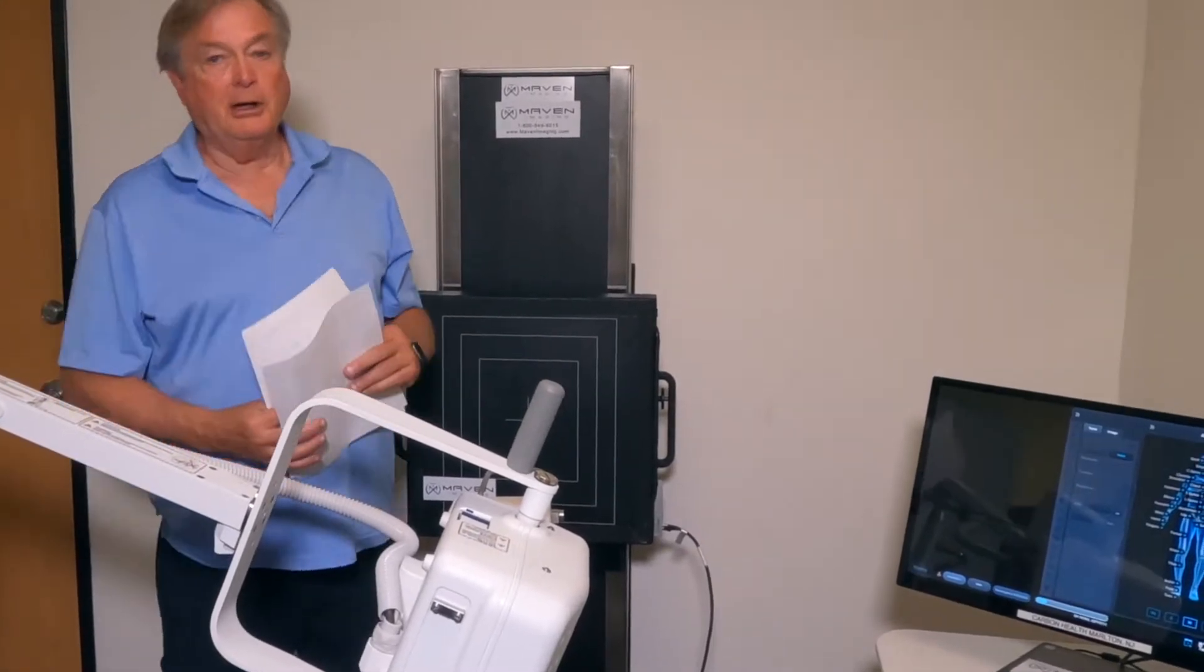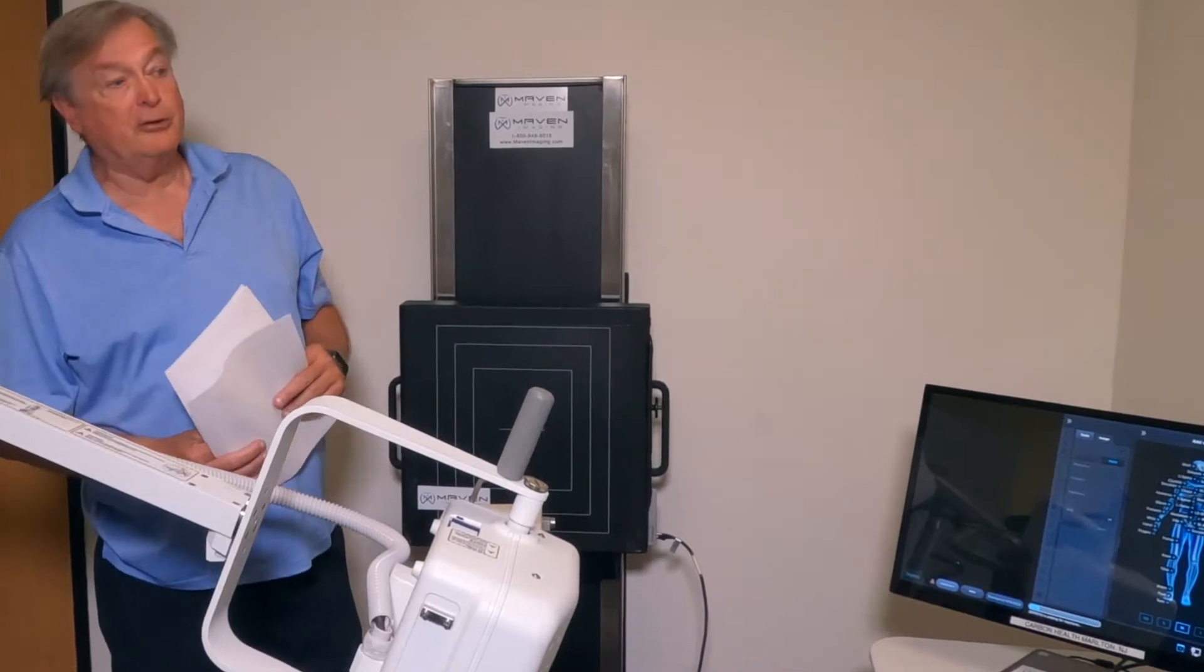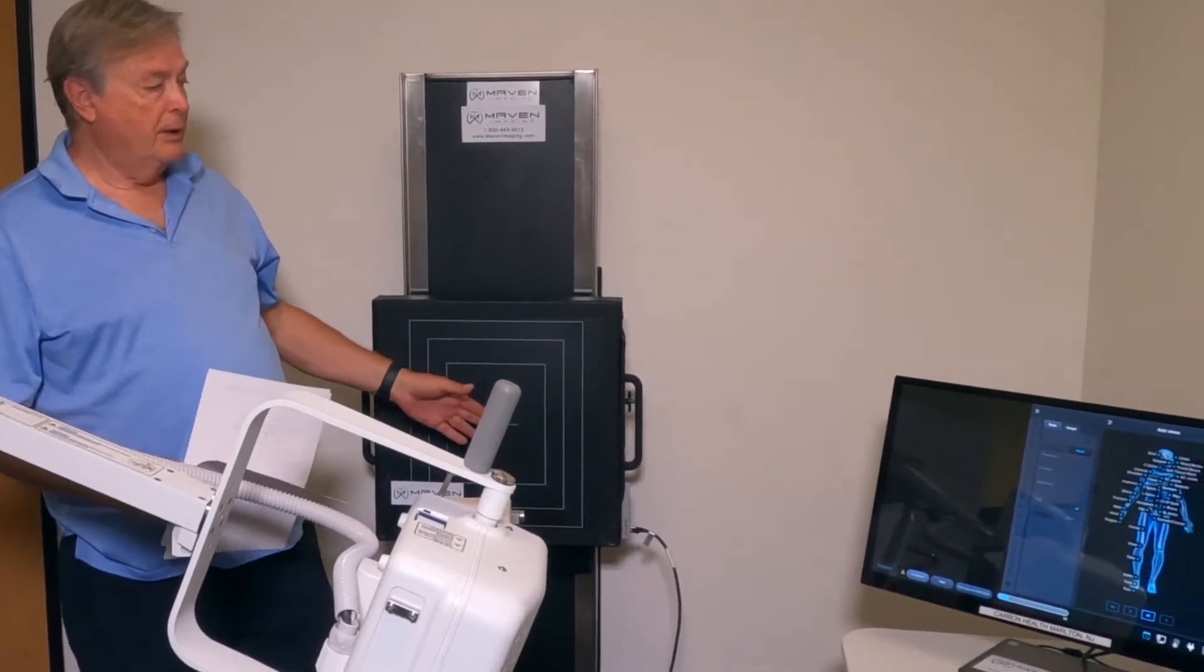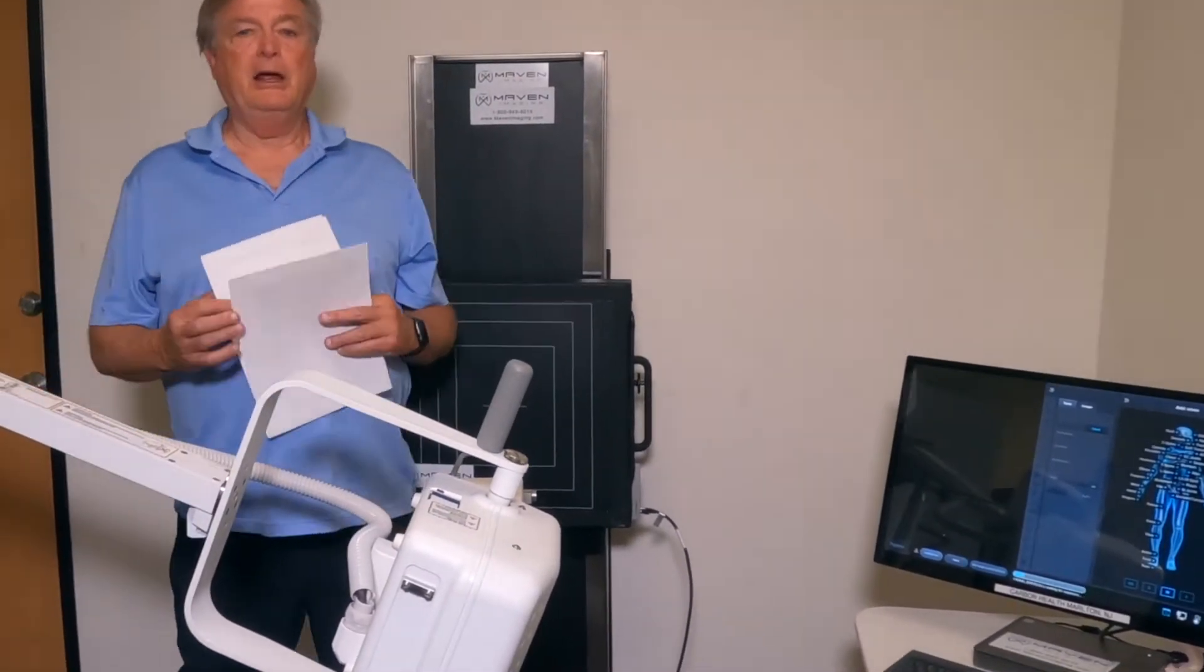Okay, welcome to Maven Imaging. Today we are going to discuss how to use a Dragon portable x-ray unit with a wall pad unit with the Void software.